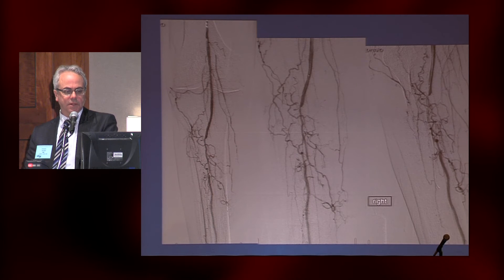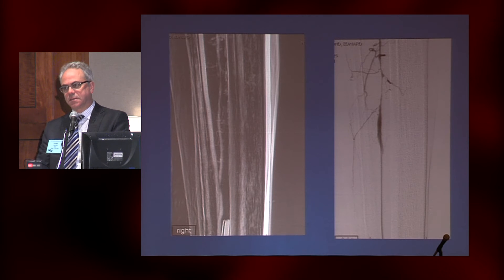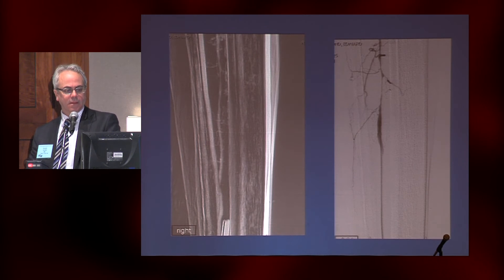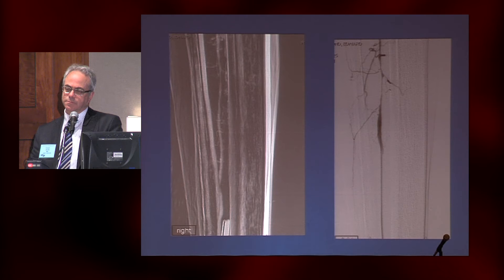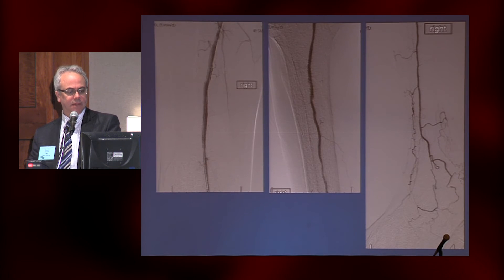Here's a patient with a two-stage intervention — a FEMPOP and a tibial. There's really no inline flow, reasonable collateral but no inline flow to any tibial. The use of Roadmap is really frustrating when working on the foot — it's really all about fluoro, and intermittent injection from above to see the target vessel. Here on the right is an access needle in, and we got up and through. I'll point out a drug-eluting stent in the area that was totally occluded.